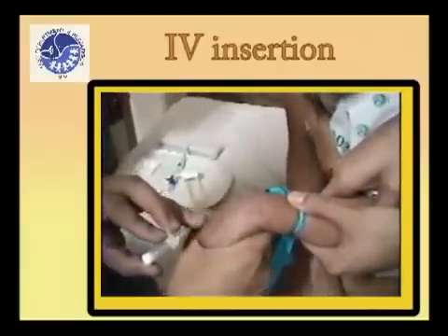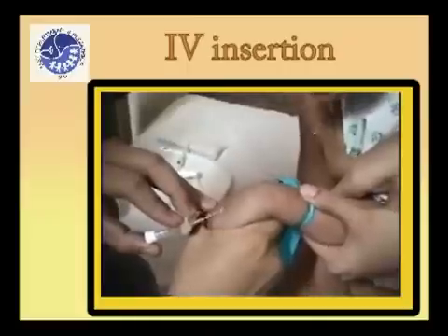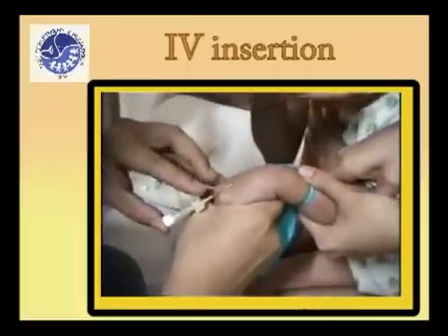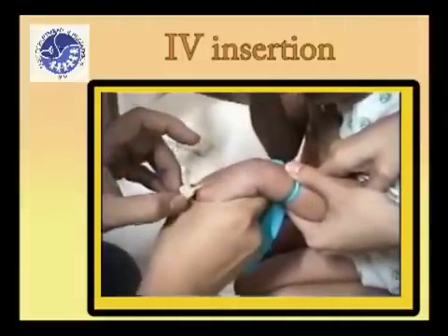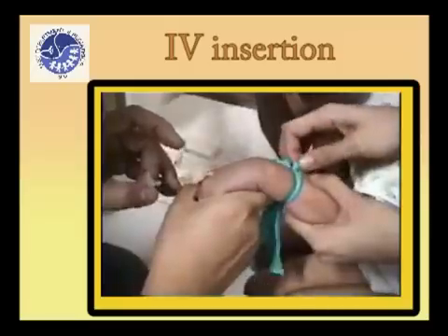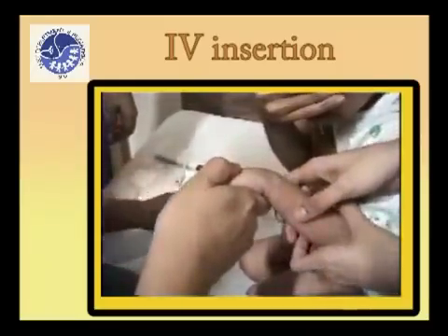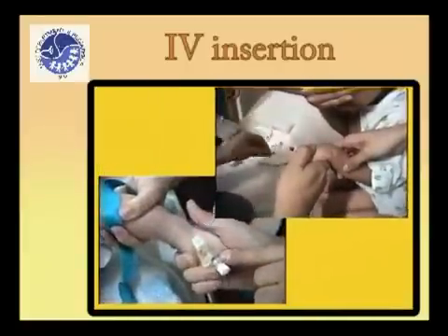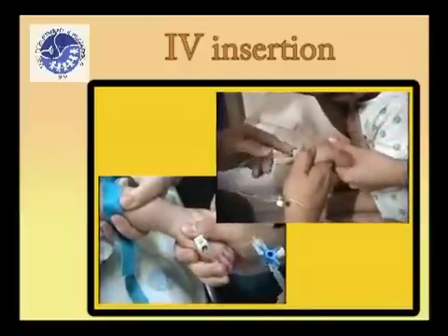Select a vein in the metacarpal area. Stretch the skin taut over the dorsum of the patient's hand and pull distally in the opposite direction of the needle insertion. Check the patency of the system by infusing 2 or 3 ml of saline from the syringe. Connect the infusion set and regulate the drip.